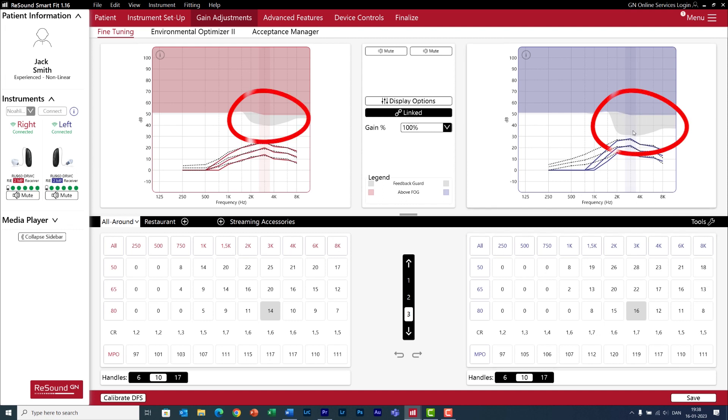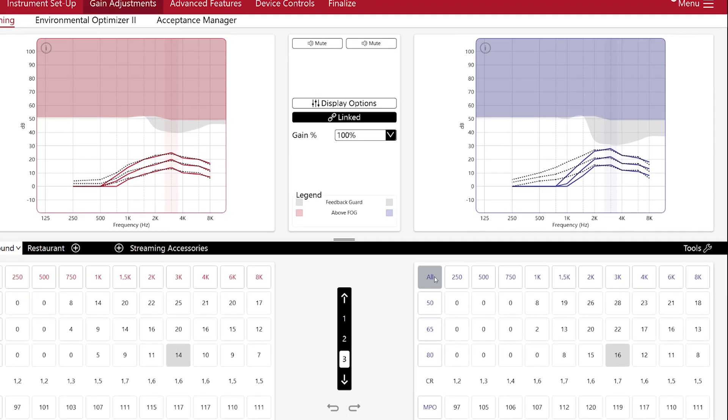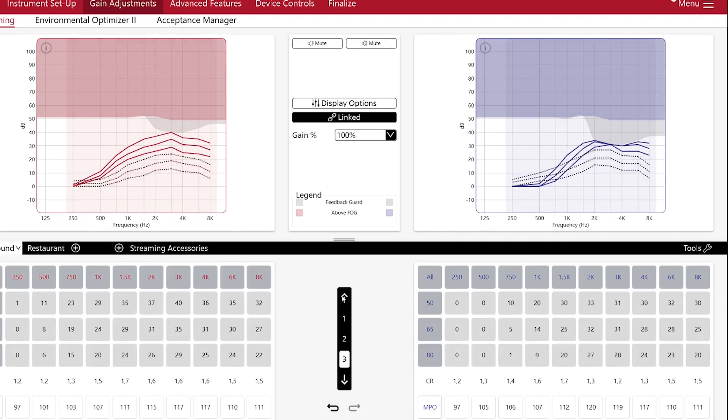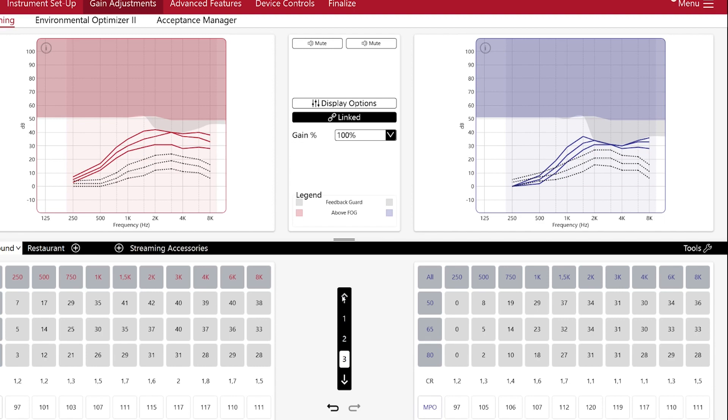This is the risk of feedback area. And let me show you what happens if I increase the gain within this area. So, I increase the gain, up, up, and oh, check this out. I cannot give more gain.